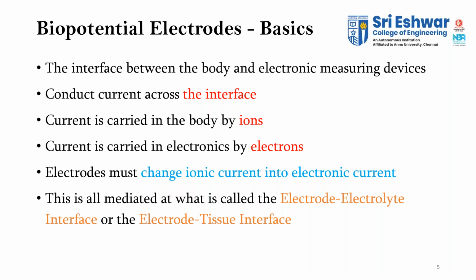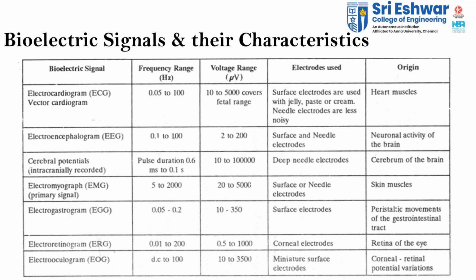And these are bioelectric signals and their characteristics. The first one is the electrocardiogram, ECG. Already we have discussed this in the previous classes, I hope.